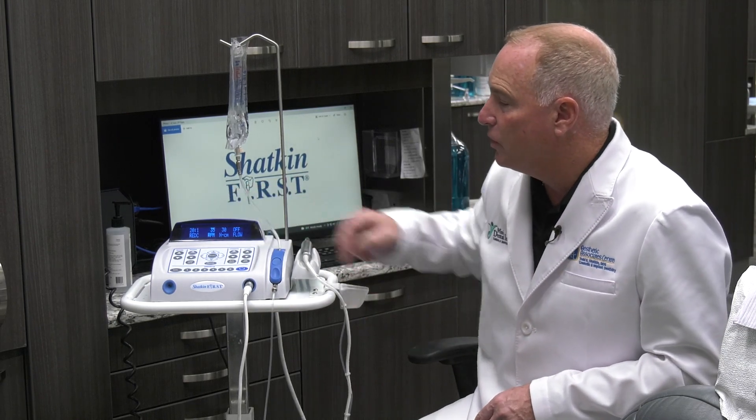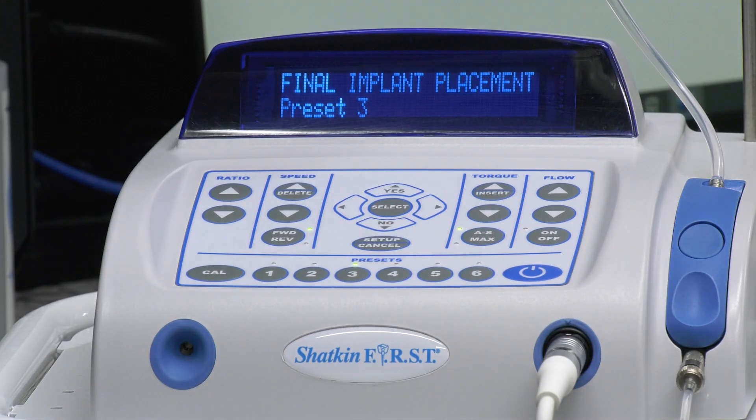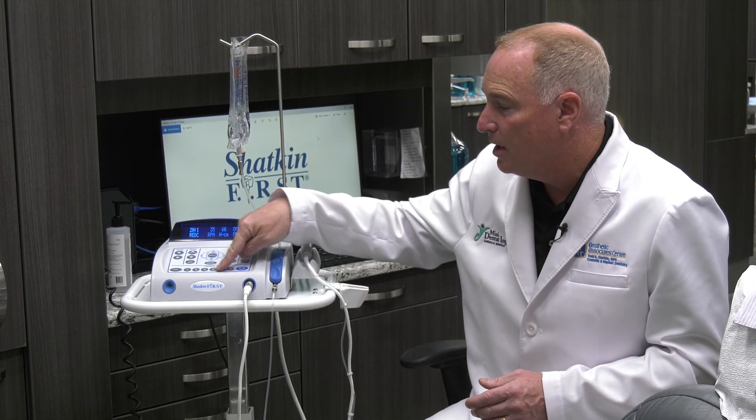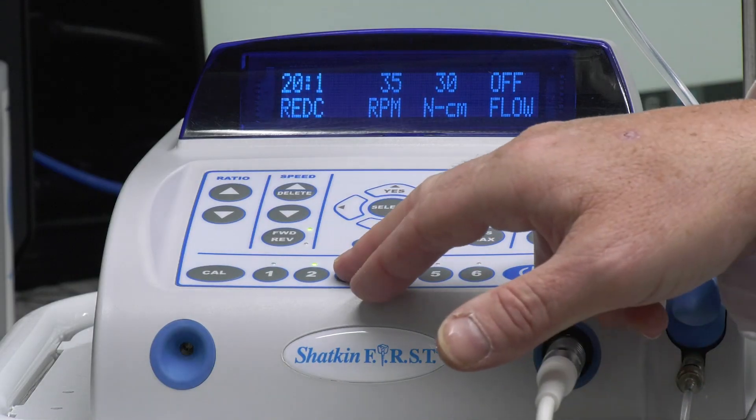That means you can pick up the housings or you can cement a crown or multiple crowns on multiple implants. Now once you get to 30 newton centimeters of torque, you go to setting number three. Keep in mind all of these controls can be controlled by the foot pedal — you don't need to touch the keypad.